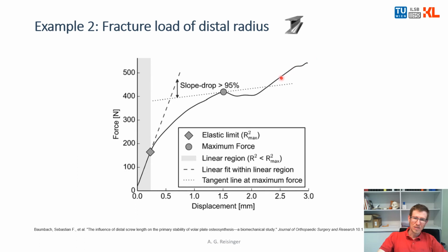The load can be increased more and more, but the actual failure, where the implant bone construct is failing, is here.